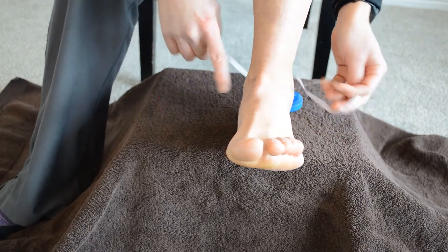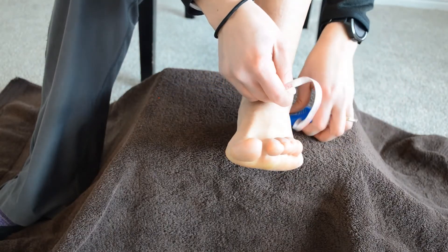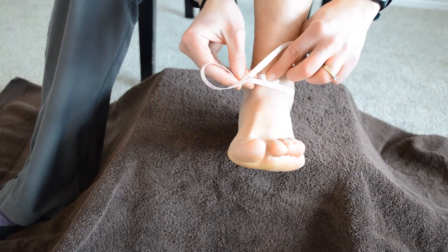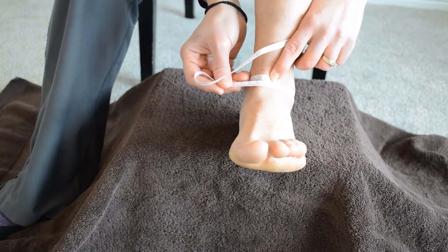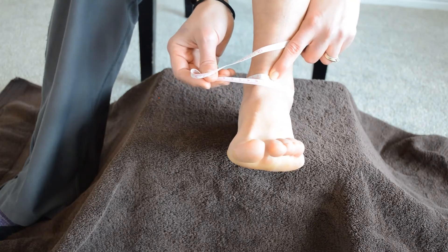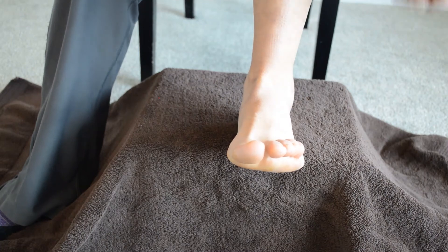I also like to take a circumference of the malleolus, just crossing around both of them together and taking a simple circumference, just to get an idea of where that swelling is sitting. Right there is 24 centimeters, and again, taking that measurement on both sides.